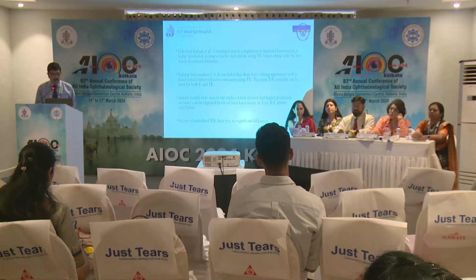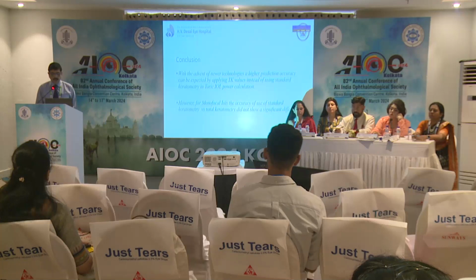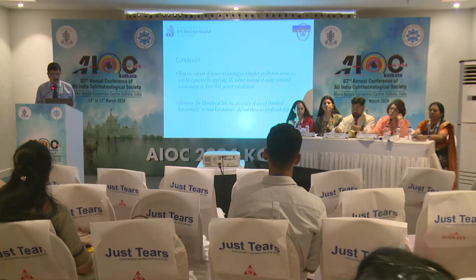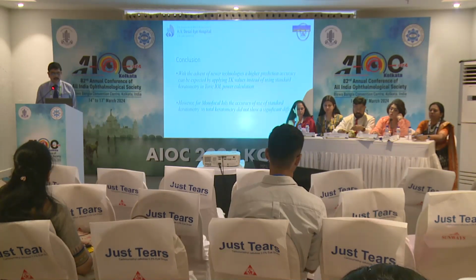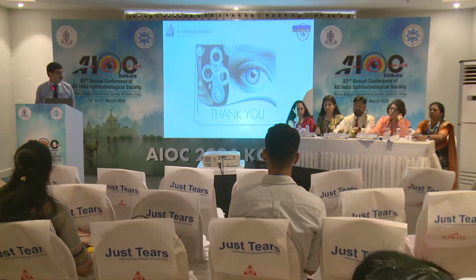Some other studies also have corroborated our findings. So with the advent of new technologies, we can use TK, which is available in machines like the IOL Master 700, for toric IOLs, but for monofocal IOLs, it did not seem to make much of a difference. Our references, thank you.